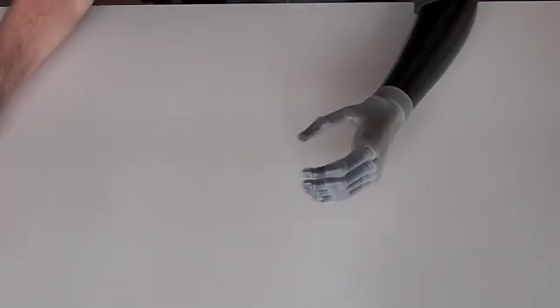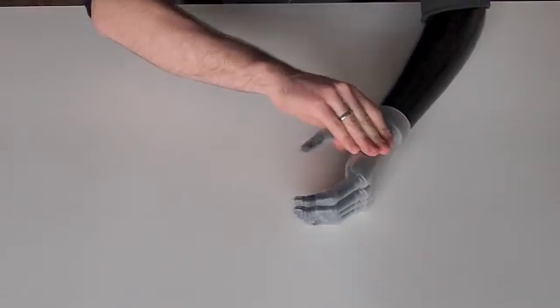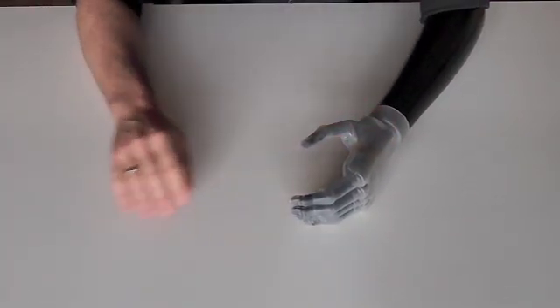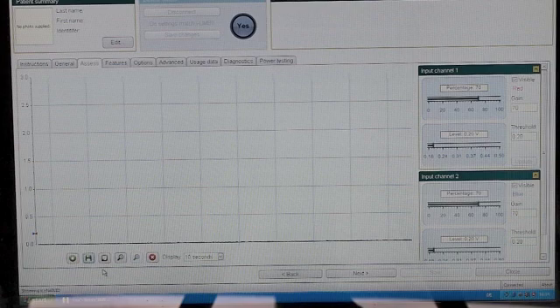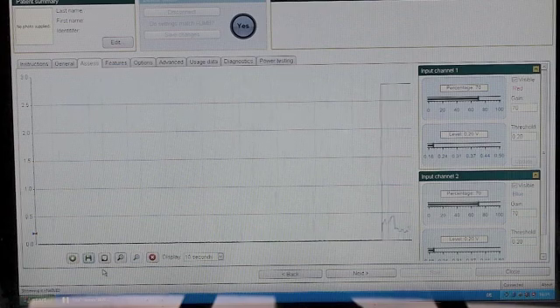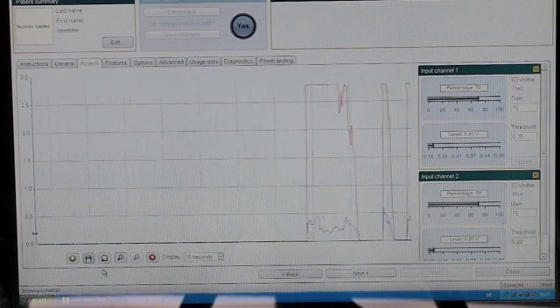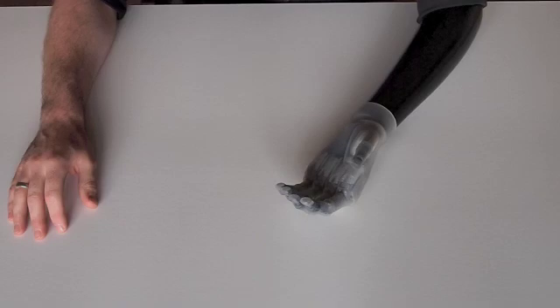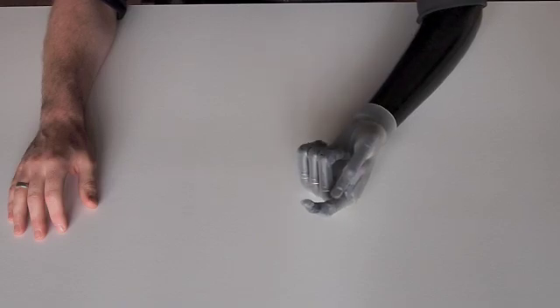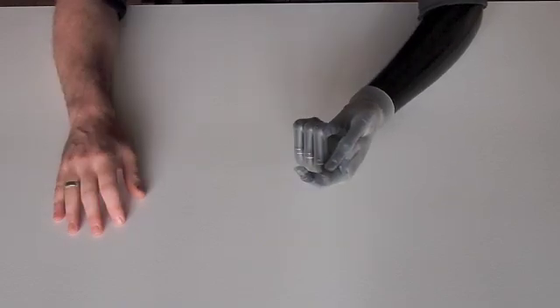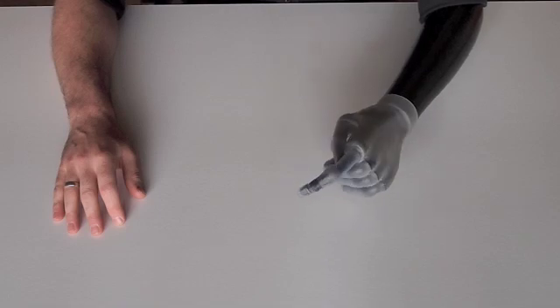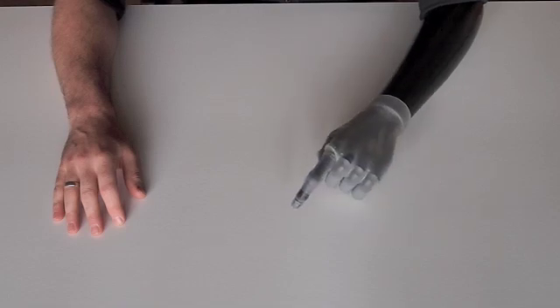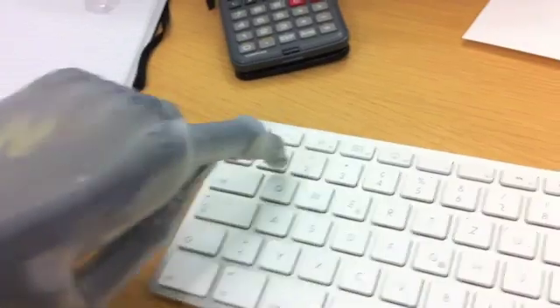My next grip mode is called index point. I activate it by sending three quick impulses to the opening electrode. One, two, three. It is very useful, for example, for typing, which I have to do a lot at work.